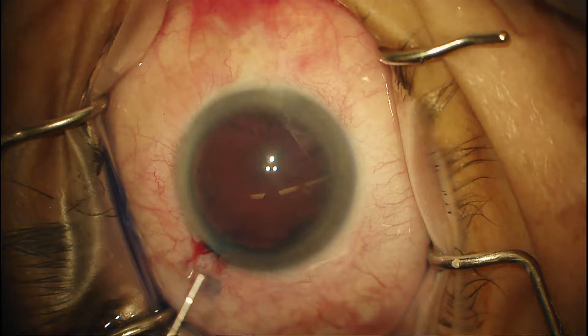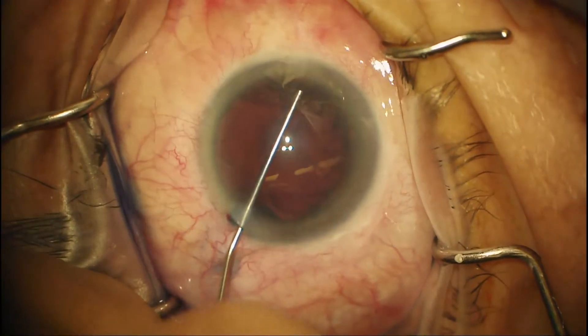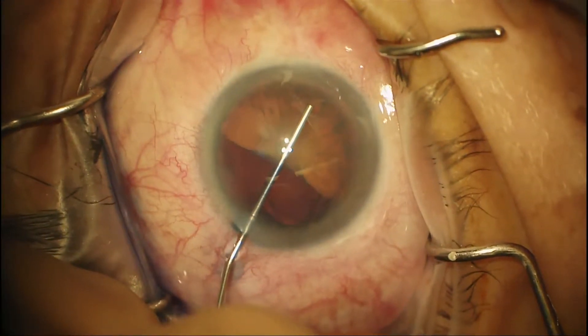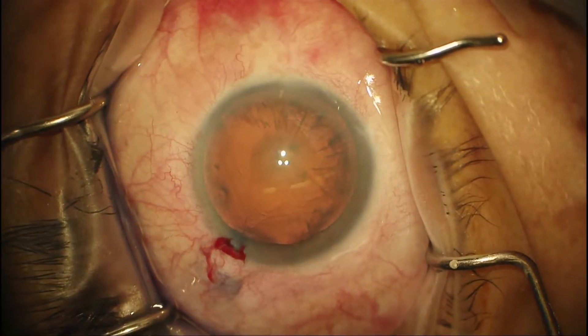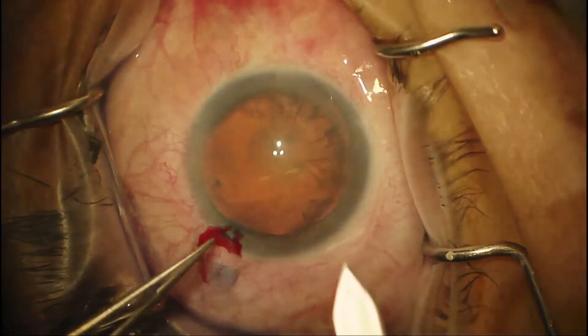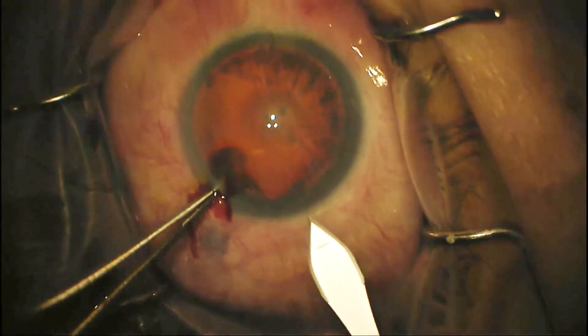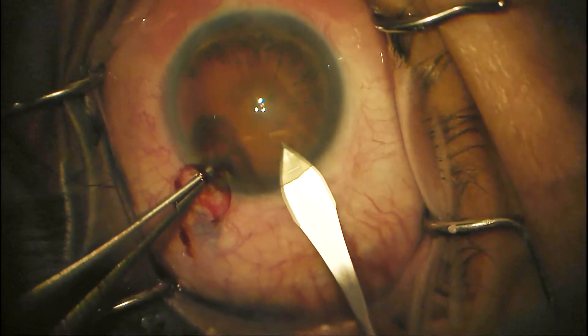This case has nice dilation and we're going to pick it up after making the paracentesis and injecting the vision blue. I've put in the viscoelastic there and it brought out the rest of the vision blue. Now we have a good red reflex and we're going to use the 2.65mm keratome to construct a temporal wound. You want to make about a 2 to 3mm tunnel — almost like a rectangle to a square type shape — and that tells you that it's long enough.